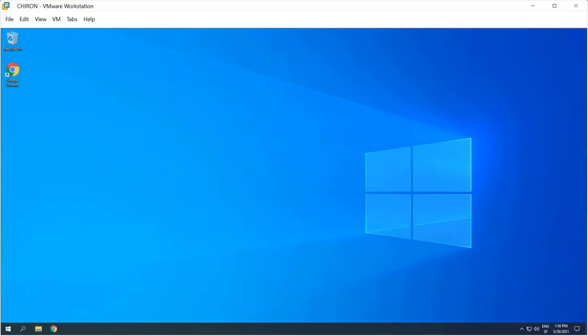Hello and welcome to this video where I will show you how to install QuPath from scratch, and also a second version of QuPath that I will compile to be able to launch scripts like Stardist.